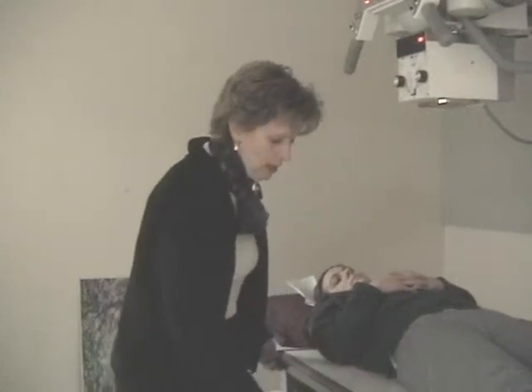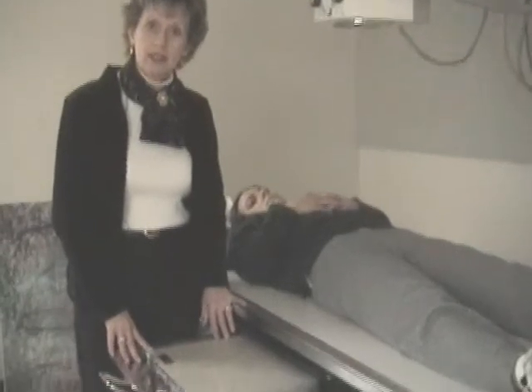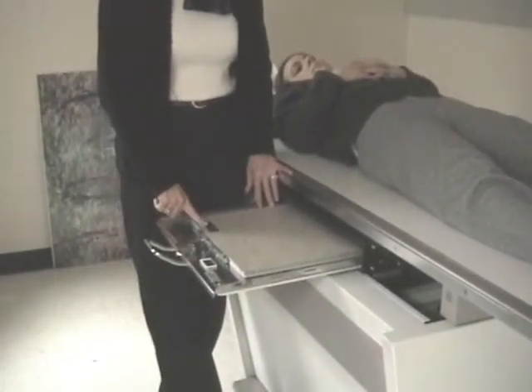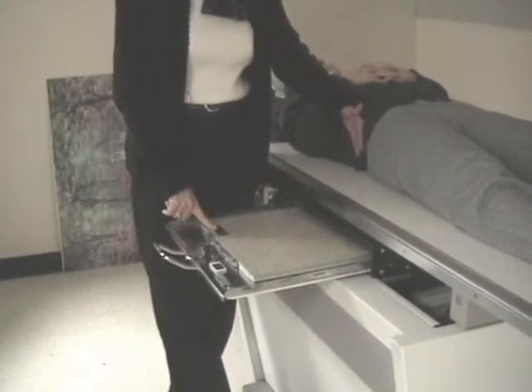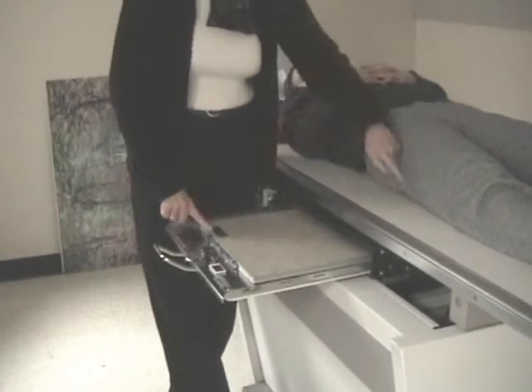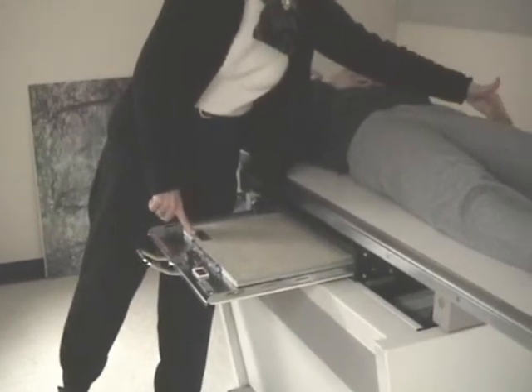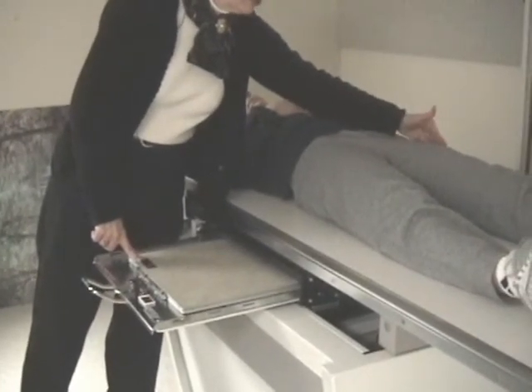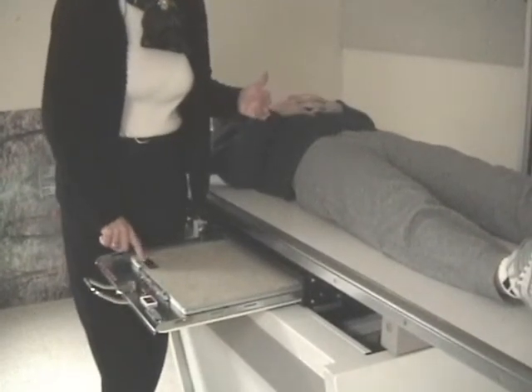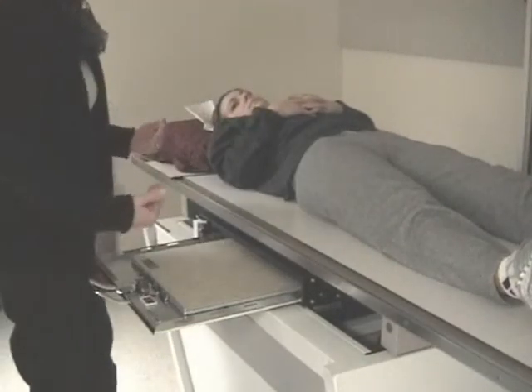Patient is recumbent on the table. I'm using a 14 by 17 film crosswise. I think you can see that it's in a crosswise position. The ID marker is towards the wing of the ilium. If it wasn't here, it would be down over there, on this side of the patient near the trochanters. More problems happen over the trochanter region, so we keep it up by the crest region. Okay? So the ID blocker is towards the technologist, in other words.